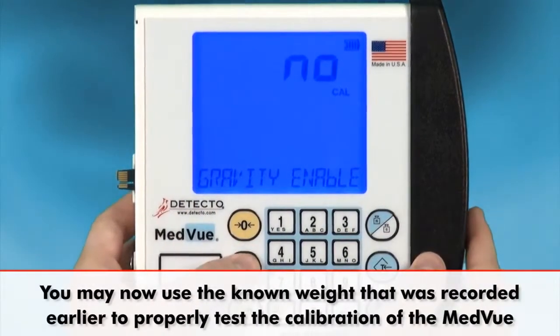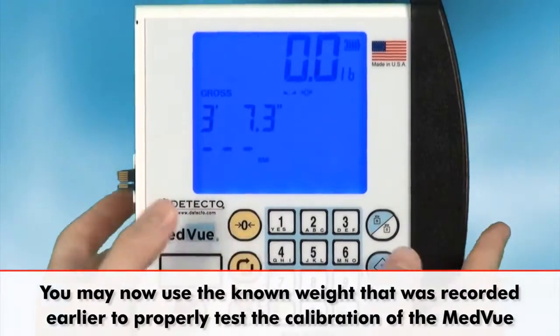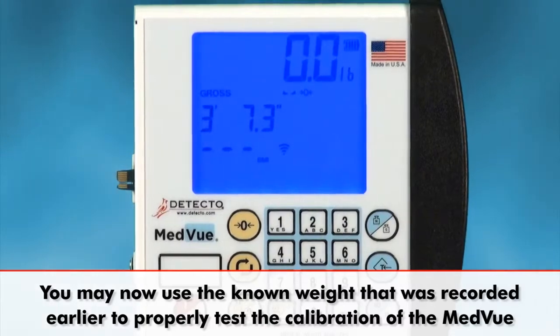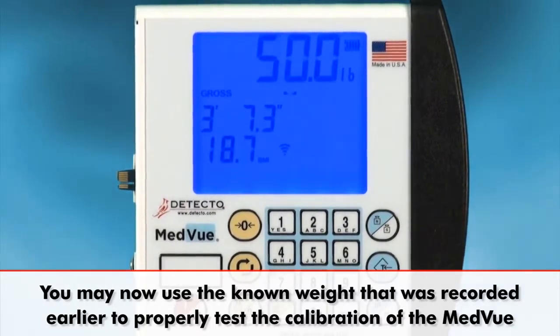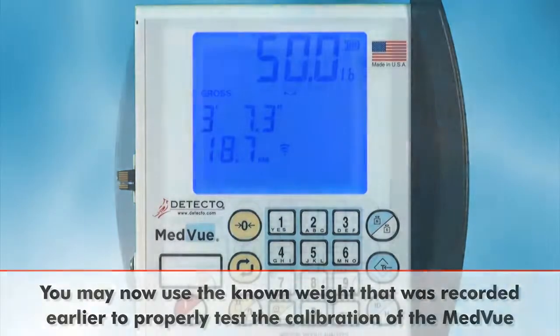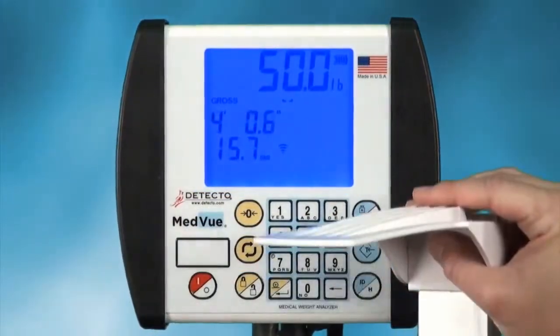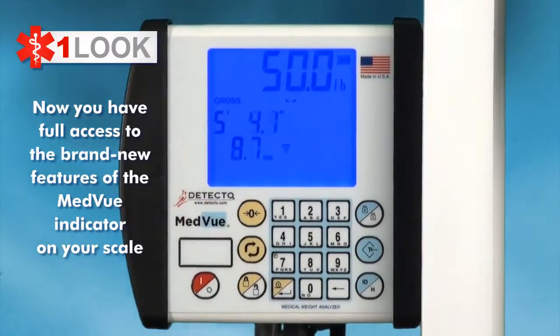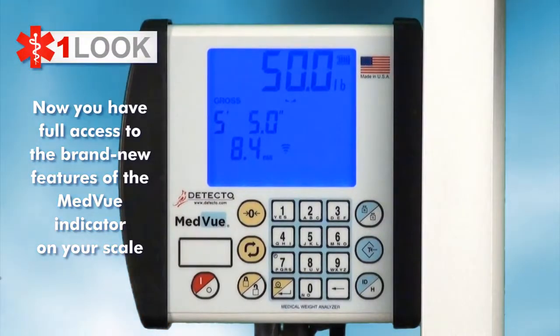If you don't have any standard weights to use, you can now use the known weight that was recorded earlier before removing the old indicator from the scale. That object's known weight is helpful at this point to test the new MedVue's calibration. Now that you've successfully completed those steps, you will have full access to the brand new features of the new MedVue indicator available on your scale.